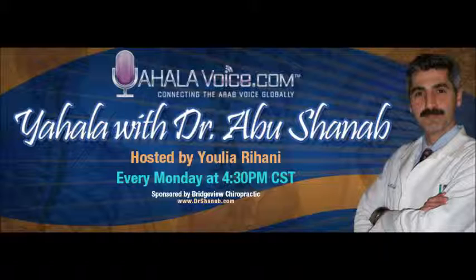The closed MRIs are quite noisy, and people who are claustrophobic really cannot take it. Yes. But is the closed MRI giving better images versus the open? Or is the open one okay as well? If the strength of the magnet is similar, open and closed MRI would have equivalent image quality. A lot of patients bring in their CDs to our office, and the image quality does matter, especially if the patient is a little bit overweight or anything of that nature.